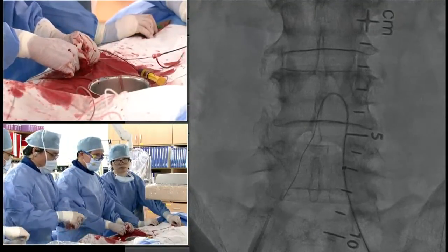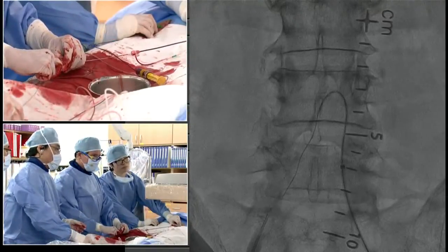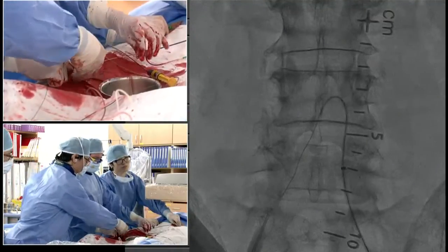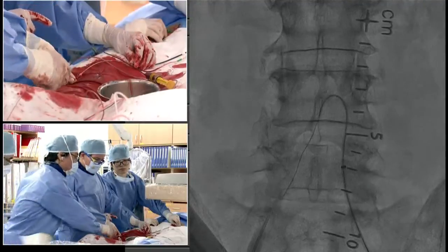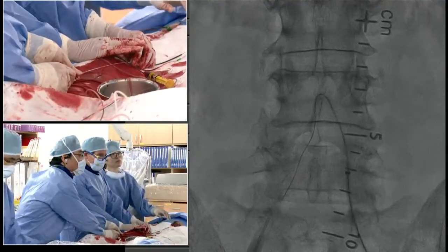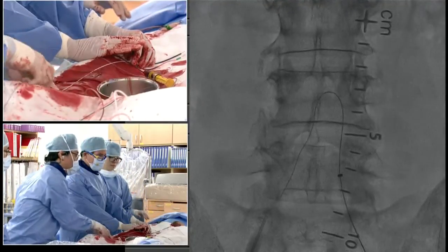And then of course, if you came from the arm, you would hopefully be able to put a multi-purpose type curve right into the stump and have very good backup support to try and cross. Don't pull that wire back at all. I usually just form it in the arch. I know that's blasphemy to some people, but it's a very simple procedure. It just takes 30 seconds.